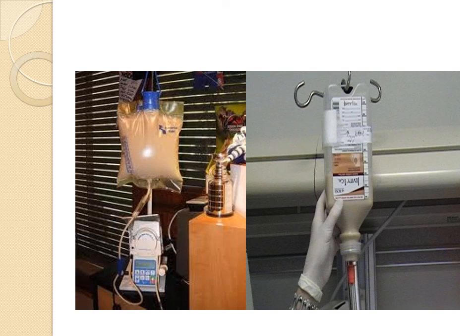And then this way they're instilled very quickly, just like you normally eat. You don't normally eat continuously over 20 hours. So they'll get their bolus, and then that has to be absorbed. If we're doing that, same stance. You should never have that patient laying flat once they've received that bolus feeding.